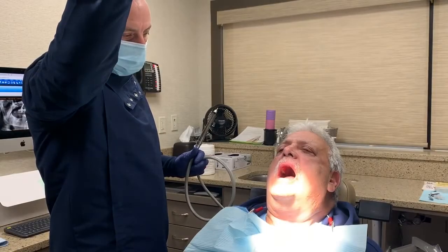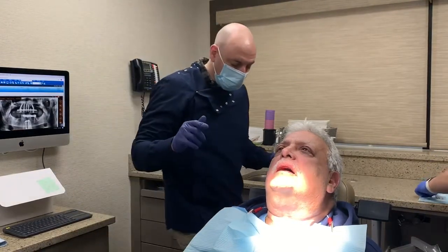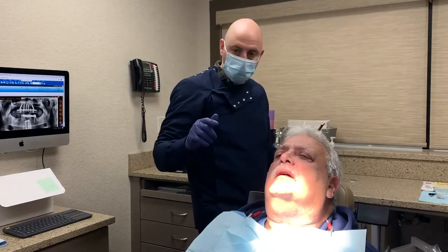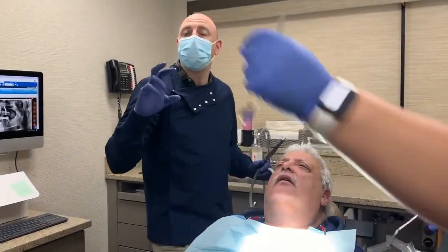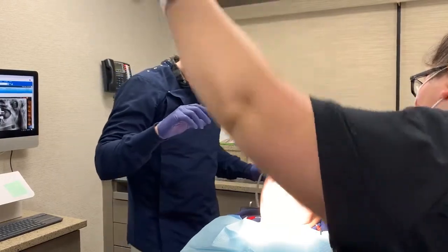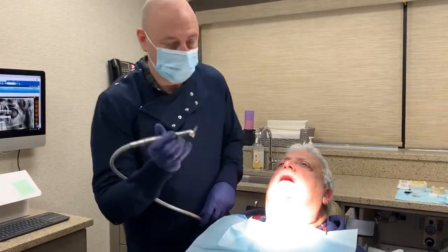Now, does it matter what teeth they use to set? Well, you're setting the teeth based off of the pre-op. Okay, I'm saying the teeth that they actually have in here, are these the same material as the teeth that are going to be in? No, these are denture teeth. These are just denture. And then what they'll do is they'll scan the entire prosthesis, and then they'll fabricate it off of it.